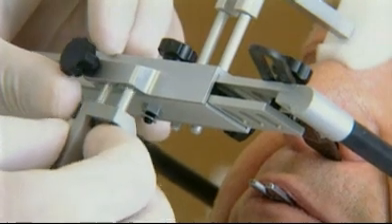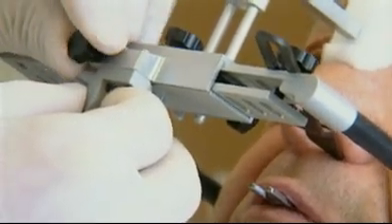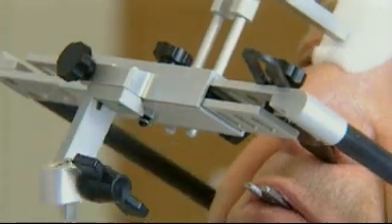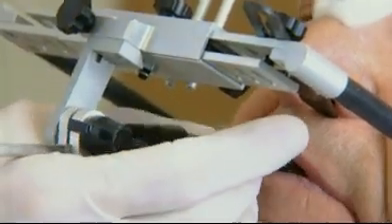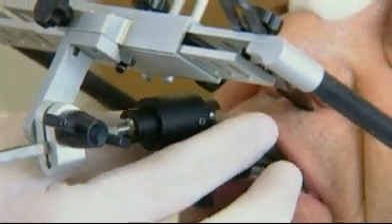Next, insert the open registration joint into the guide at the transfer bow, and the other end into the UTS adapter of the registration and tighten the corresponding screws.